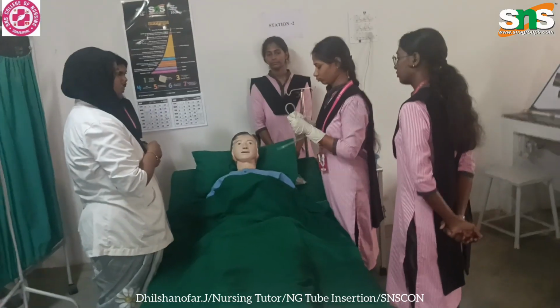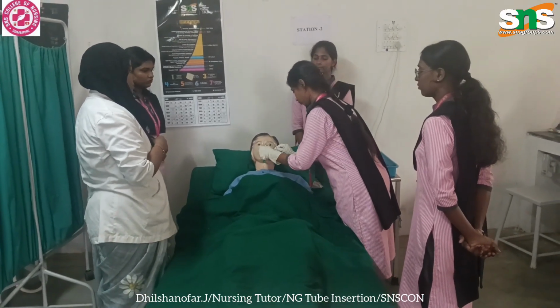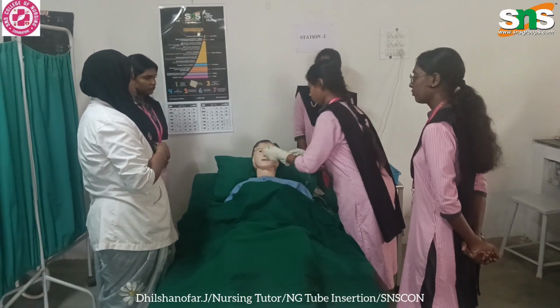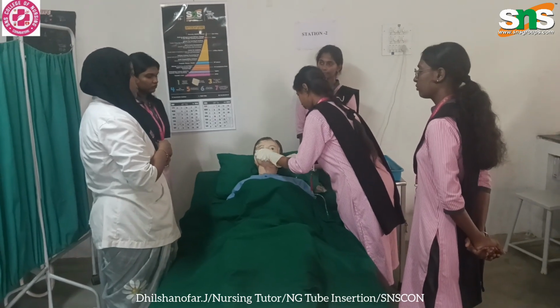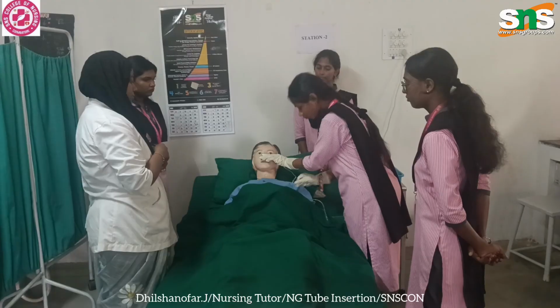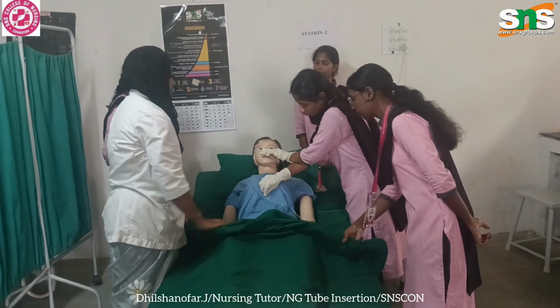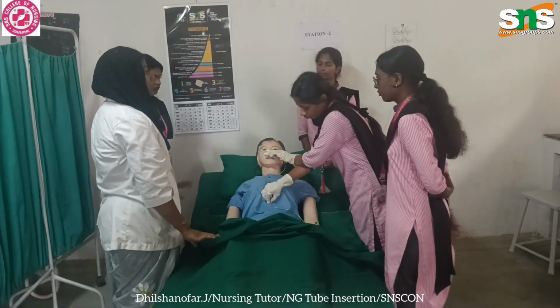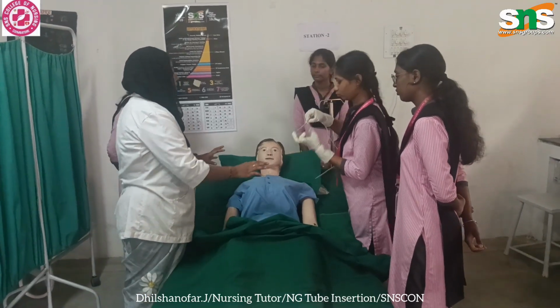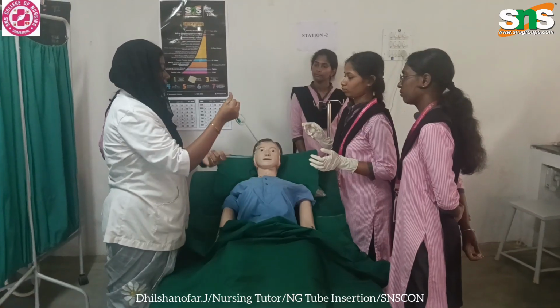How will you measure? The NG tube measurement is, you have to measure from the tip.